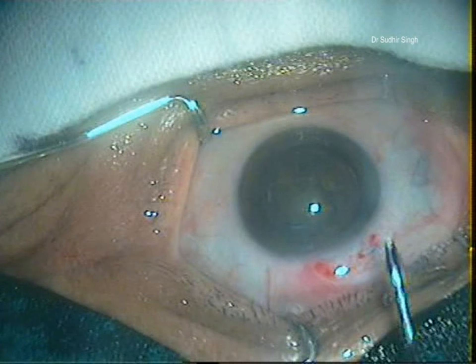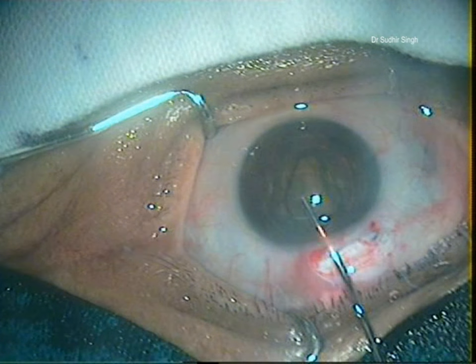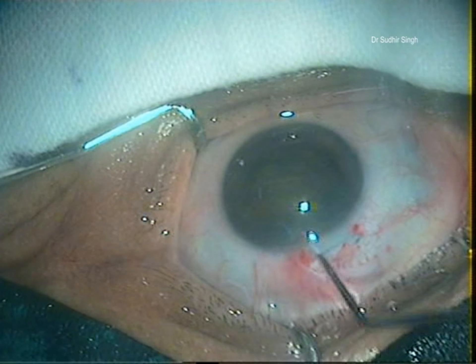The nucleus is prolapsed into the anterior chamber with the Sinsky's hook. Enough viscoelastics is placed between the cornea and the superior surface of the nucleus, and between the inferior surface of the nucleus and the iris.